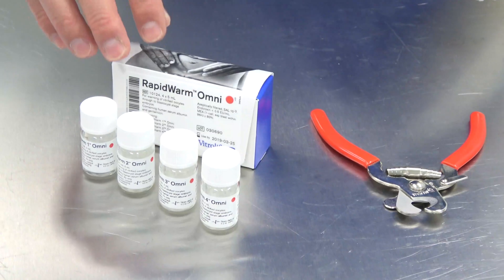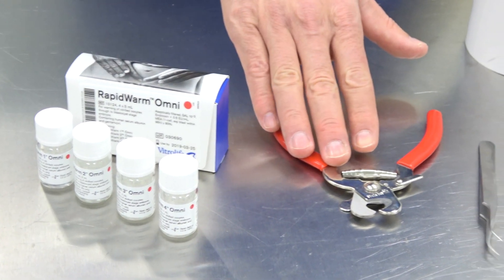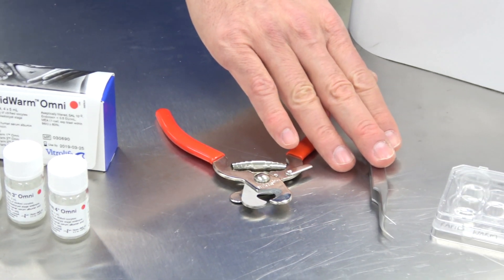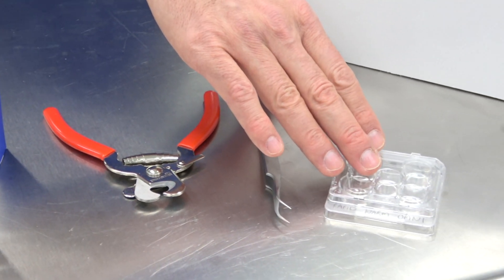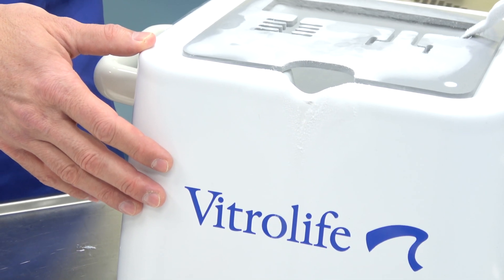I am now going to demonstrate how to do warming using the Rapid Warm Omni Kit. This kit consists of 4 solutions, the RapidEye cutter, the RapidEye forceps, the VitriLife 5-well culture dish, and the smart box containing liquid nitrogen. Place between 0.5 and 1 ml of each of the warming solutions in separate wells of the 5-well dish. Place the lid on and let it warm to 37 degrees. Do not place the warming solutions in a CO2 incubator.